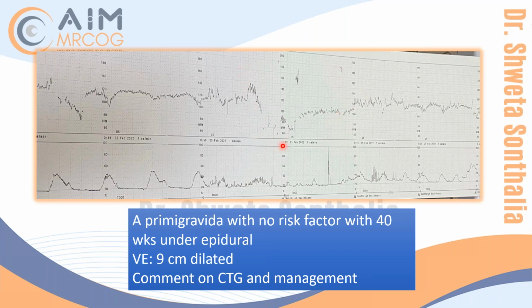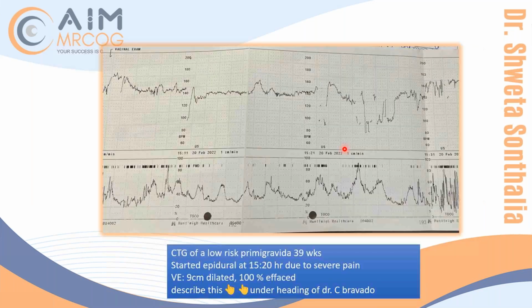What about any other deceleration you can see? No. What about initially, this one? Yes, there is initial deceleration. Even with this contraction, there is a small drop, but this is mostly variability change. Anyway, if you have eyes to look for it, you will always find some variable deceleration here and there. So I will label it as variable deceleration, because they differ in size and shape. This could be either a loss of contact or a deceleration which recovered well. So I'll keep it under suspicious and I will monitor the baby. Okay. Very good, my dear.